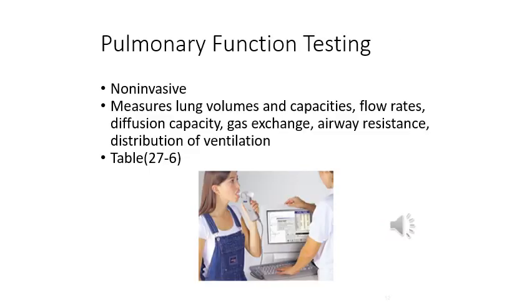Pulmonary function tests. These are non-invasive tests that show how well the lungs are working. The tests measure lung volume, capacity, rates of flow, and gas exchange. This information helps your healthcare provider diagnose and decide the treatment of certain lung disorders.